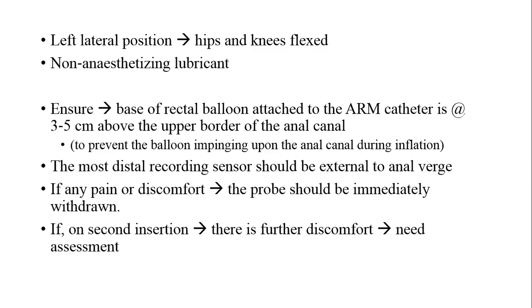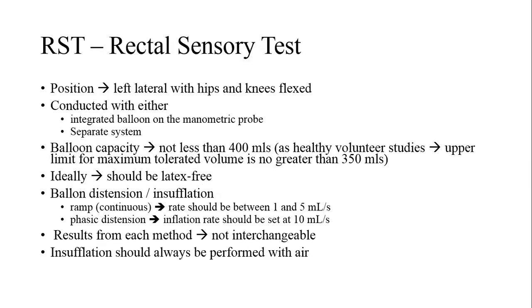If at all during the procedure the patient develops any form of pain or discomfort, the probe should be immediately withdrawn. If on the second attempt there is still pain or discomfort, then we need to reassess the patient to identify why the pain is going on.